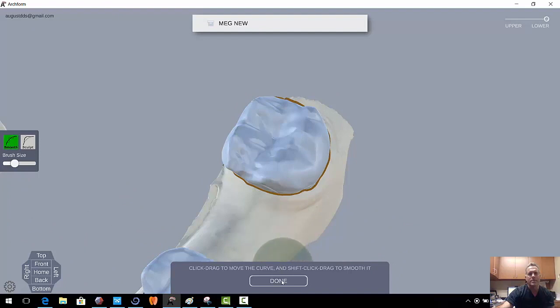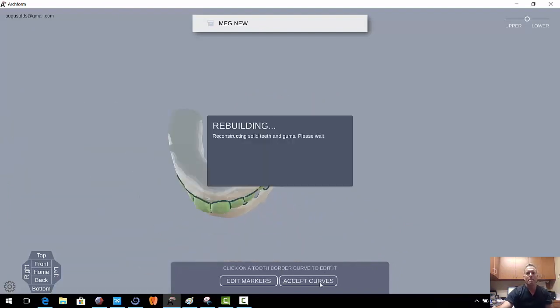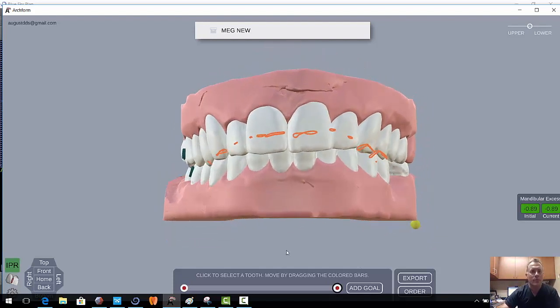And this tooth is isolated. So once we're happy with the way things work, we're going to hit Accept Curves. And let's go ahead and hit pause. Okay, we're back and we have the teeth all isolated. Now it's time to move.